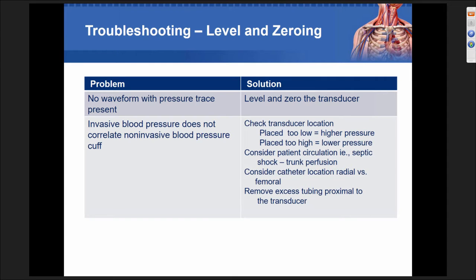If your hand is blue, cold, clammy, with no capillary refill, and you don't have great distal pulses from the insertion area, you really need to get that catheter into a better perfusing area, because the other thing that can occur is total arterial occlusion when you remove the catheter or even when the catheter is still in situ.